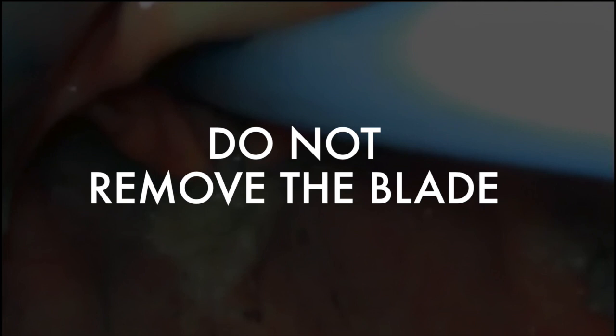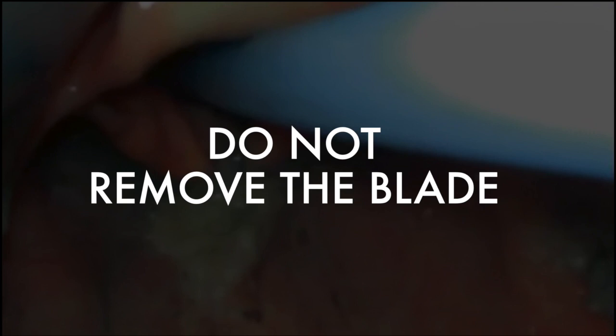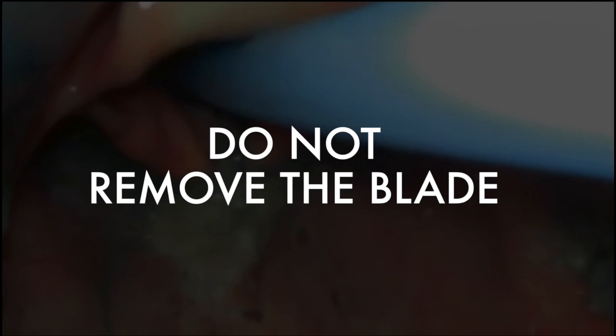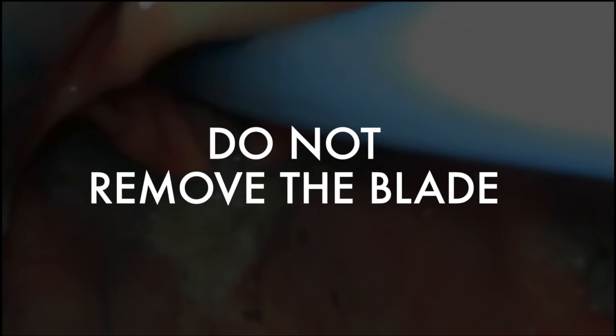After passing the bougie through the cords, do not take your blade out of the mouth — do not lose your view. This matters for three reasons: first, if you didn't advance the bougie far enough, it could migrate out of the airway without you knowing; second, the blade keeps the tongue and soft tissues out of the path of the tube you're about to pass; and third, you want to see when the balloon is passing through the cords — without the blade, you're just blindly inserting the tube.